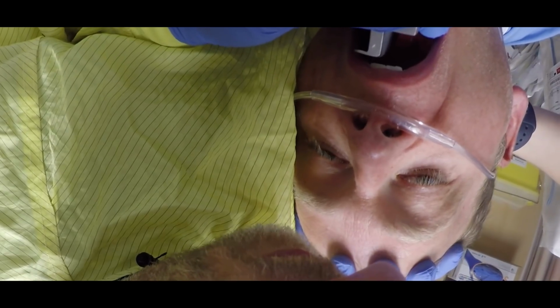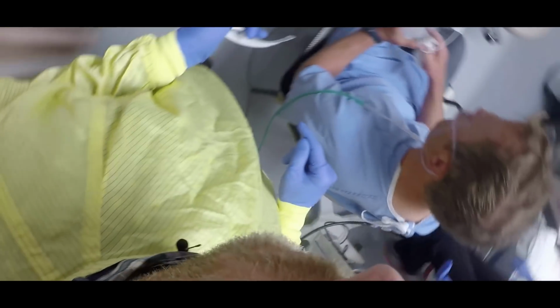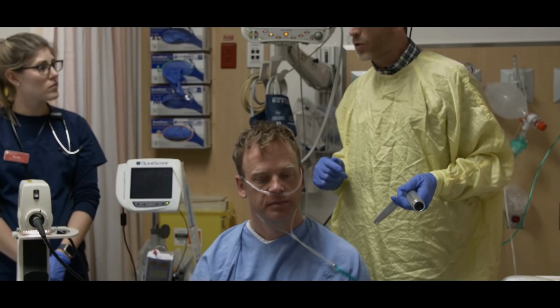I felt that feedback on the teeth. I got that. Okay. So we had a good view of the epiglottis there. Could see the posterior cartilages and could see the opening briefly between the cords.